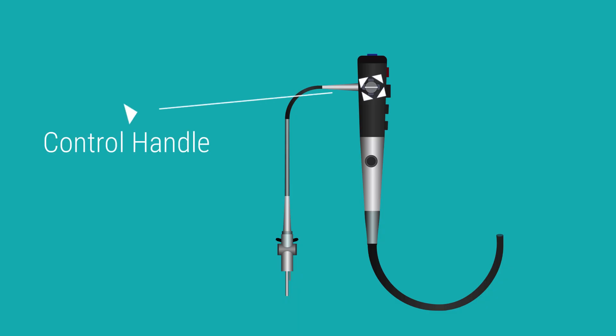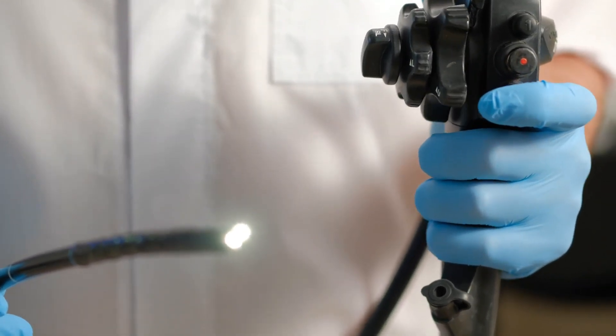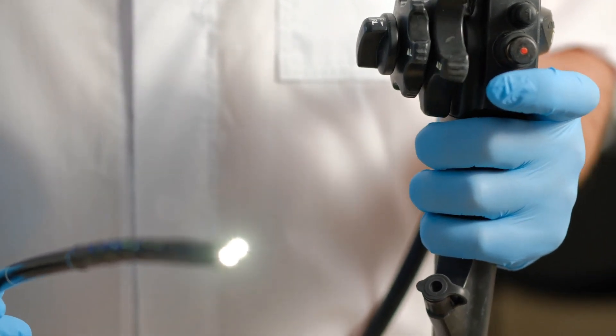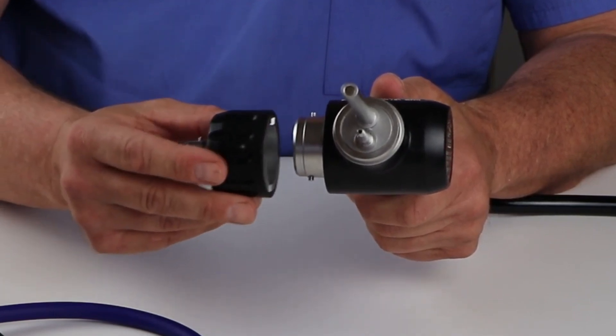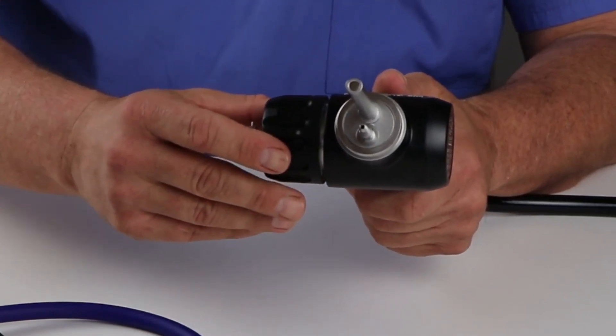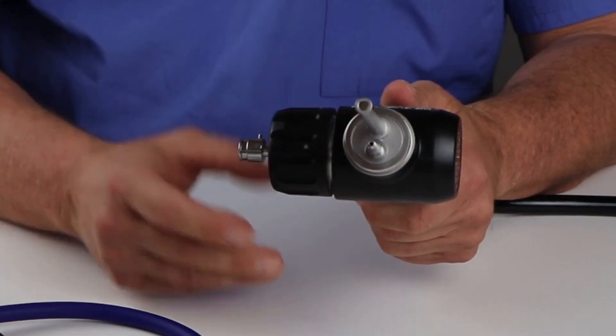The control handle, held by the operator, stays outside the body. It has knobs for maneuvering the insertion tube, working the camera, and managing other functions like air-water insufflation and suction. The water-resistant cap protects the endoscope from water penetration during cleaning, and the valve on the cap is used for leak testing before endoscope cleaning.